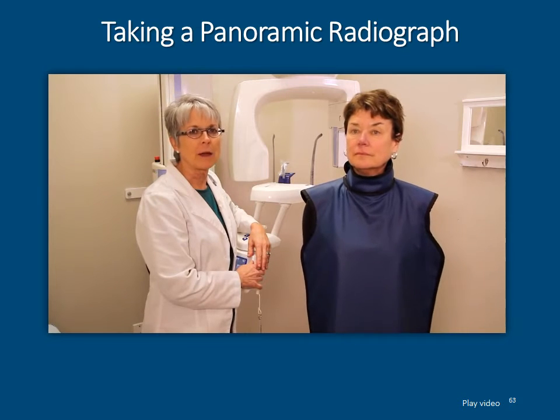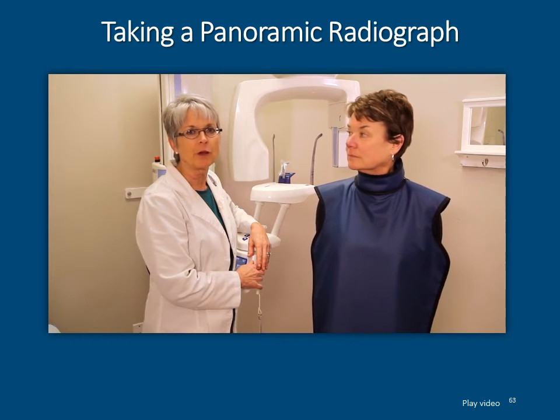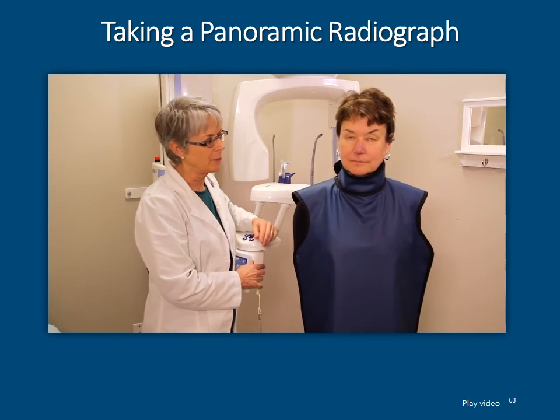Let's watch this short 3-minute video, and it'll go through the details of loading a patient into the machine and exposing a panoramic radiograph. When you're doing panoramic radiographs, you may be wondering why you can't use an intraoral apron.